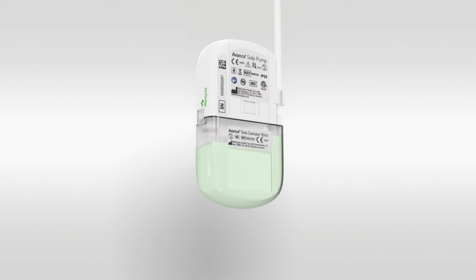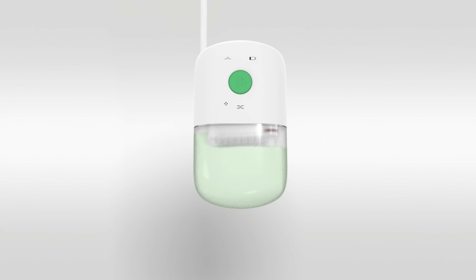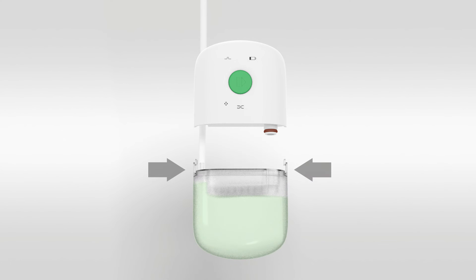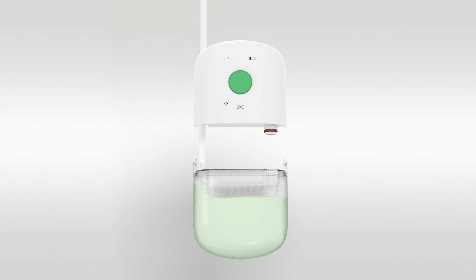First, remove the tubing from the pinch clamp. Next, depress the clear plastic tabs on either side of the pump and pull while gently rocking to release the canister. Once the tabs clear the pump housing, the canister will disengage. Dispose of the canister in clinical waste or as regulated in your care setting.